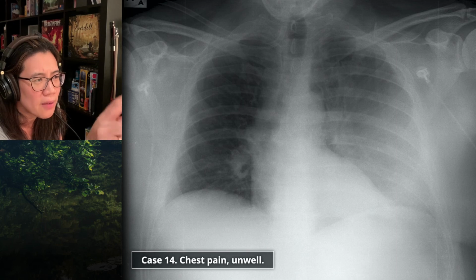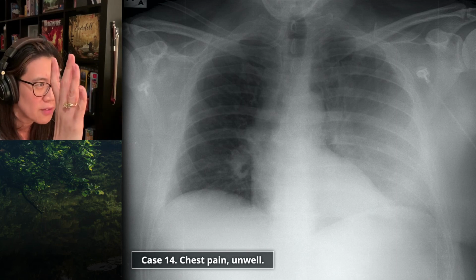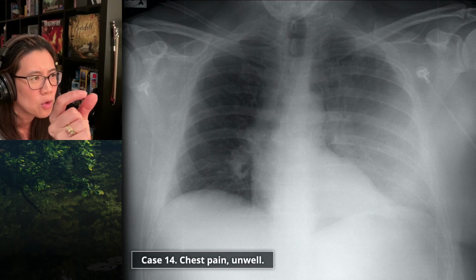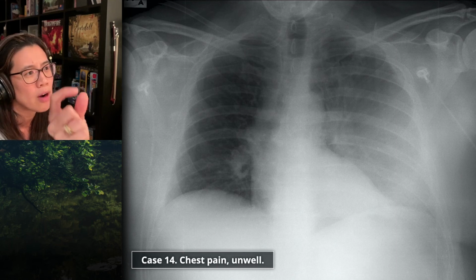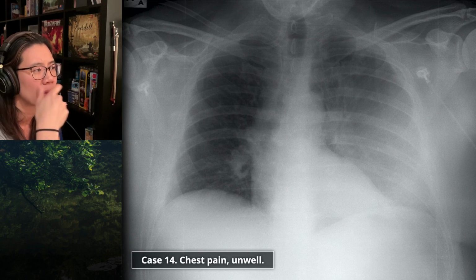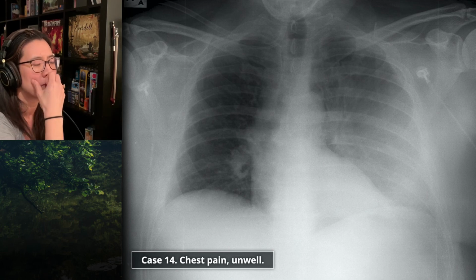Well, actually, at the superior margin on that left chest wall, I wonder whether there is some apparent pleural thickening, medial to the lateral part of the left third rib. Yeah, I think the lung is displaced away from the chest wall. So there is some pleural fluid there.